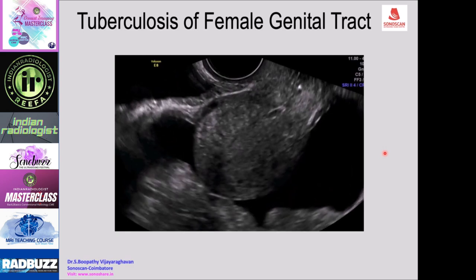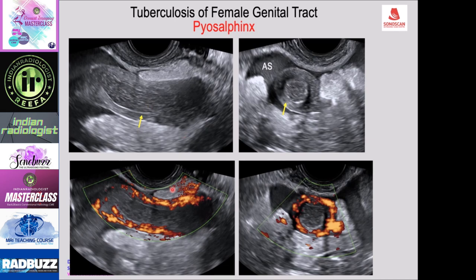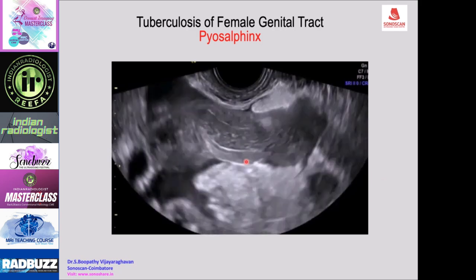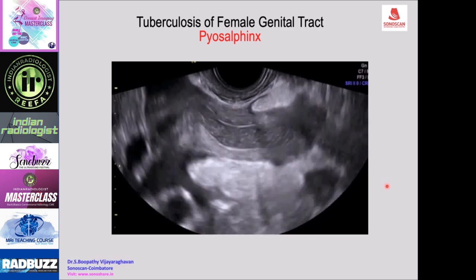In tuberculosis pyosalpinx, the markedly thickened fallopian tube is seen with adjacent ascites. In cross-section, the tube shows marked thickening with internal distension and debris. Color Doppler shows intense hyperemia of the walls. The patient does not have acute symptoms. Real-time dynamic scan shows movement of debris in the fallopian tube confirming pyosalpinx.